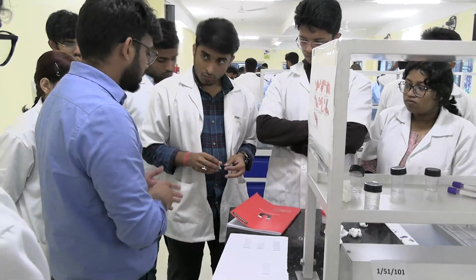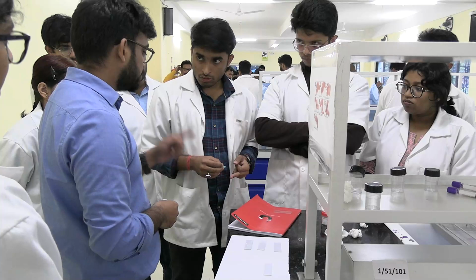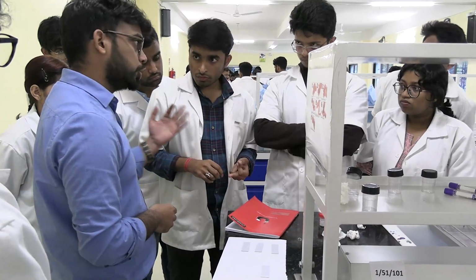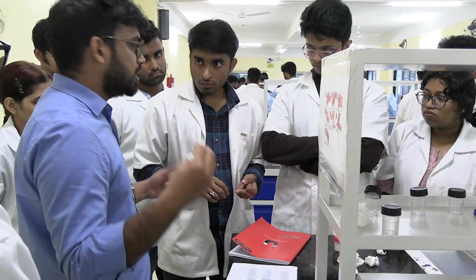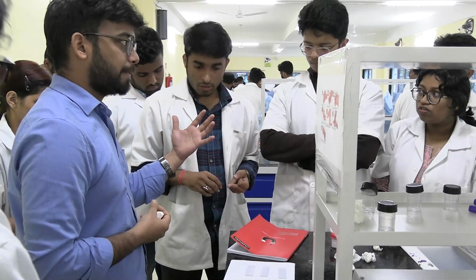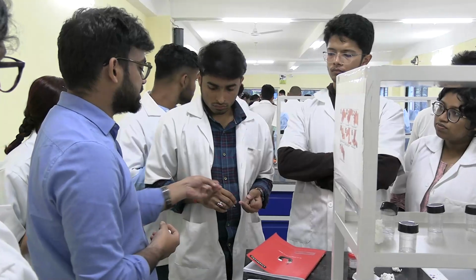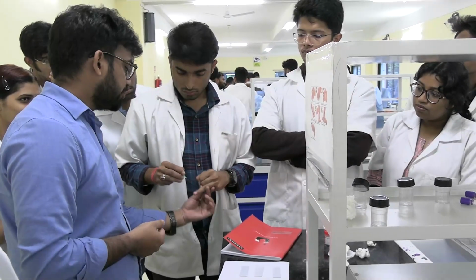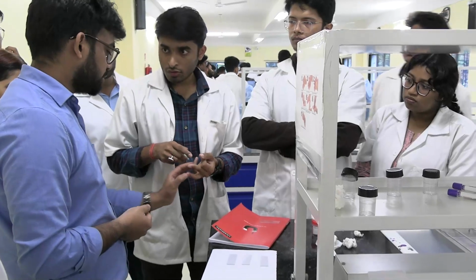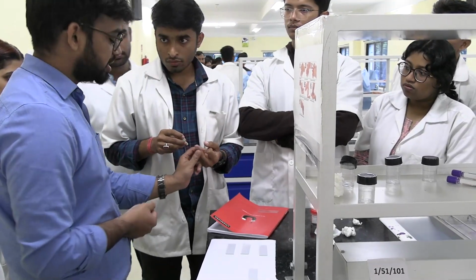Now, clean your fingers. Which finger are you going to prick? The non-dominant hand is more preferred. If you are a right-handed person, you will prick on the left hand, preferably on these three fingers. So suppose I am going to prick his ring finger. Give me your ring finger. Have you cleaned it? Now you are going to prick yourself. Yeah, then prick it.